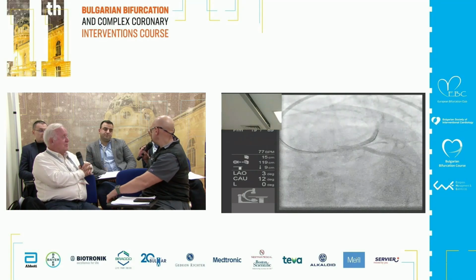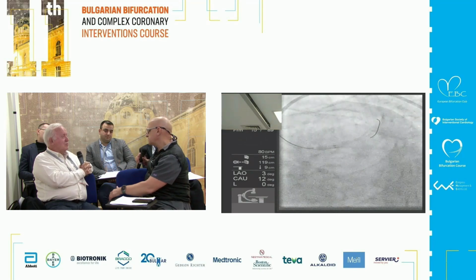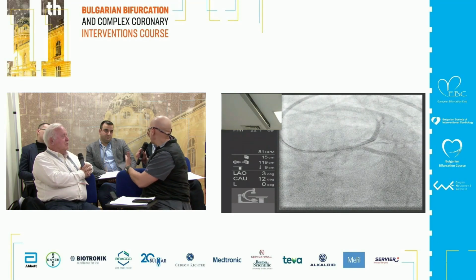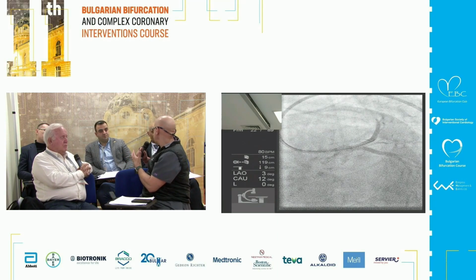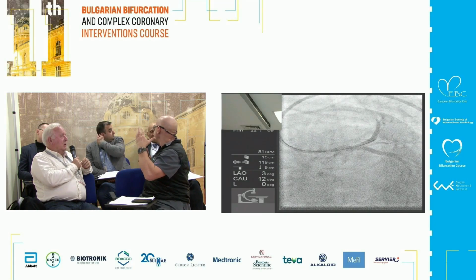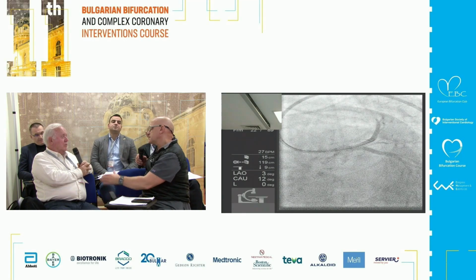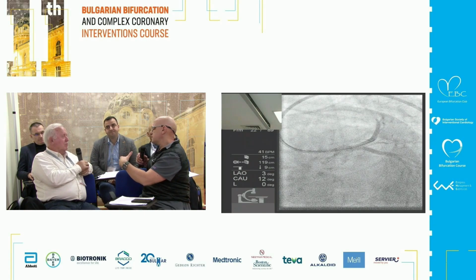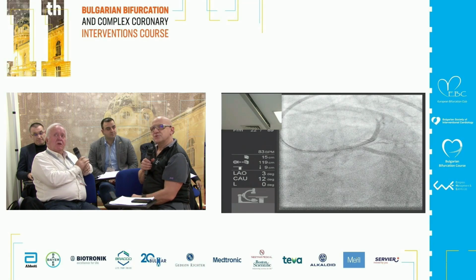I mean, the indication for intravascular imaging is to use it in left main, okay, but when you have something unclear from the angio, that's why it should be used. There should be a reasonable use of IVUS. It can only confirm what you have done, especially knowing the sizes of the side branches and the main branch and the parent vessel and so on. So you can easily do it without an IVUS.